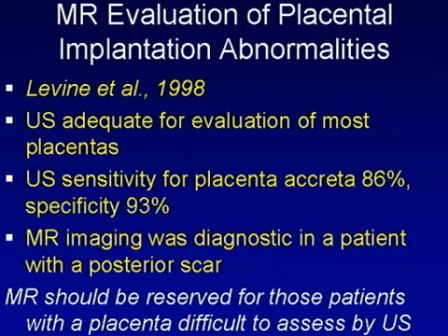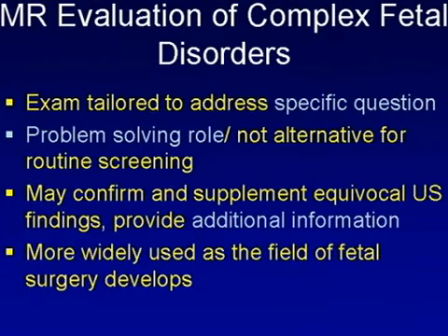And this was a series published by Dr. Levine and colleagues from Boston, and they found MR could be helpful in those patients with the placenta difficult to assess by ultrasound. And then lastly, to look at complex fetal disorders with MR.